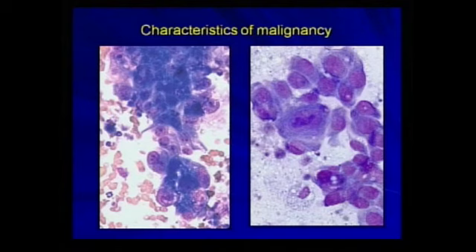We have several multinucleated cells in the carcinoma on the left, and the nucleoli are very prominent. If you take a look at the sarcoma on the right, we have one cell which dwarfs the other cell in terms of cell size, in terms of nucleus, and a large macronucleolus.